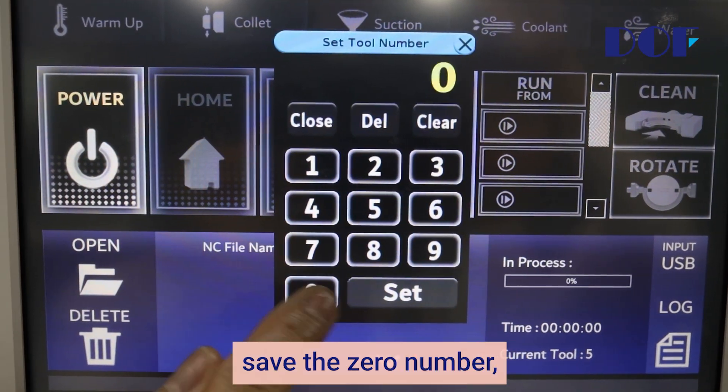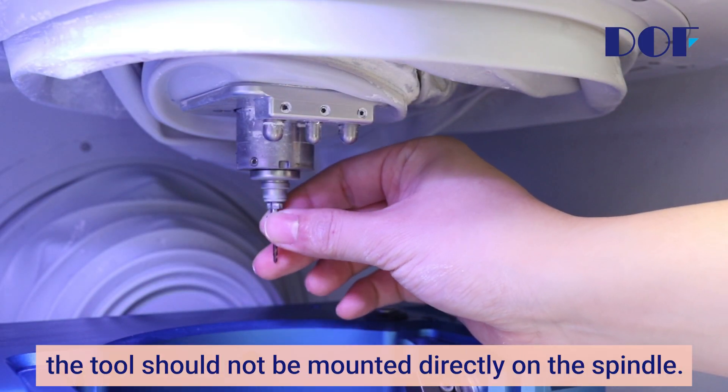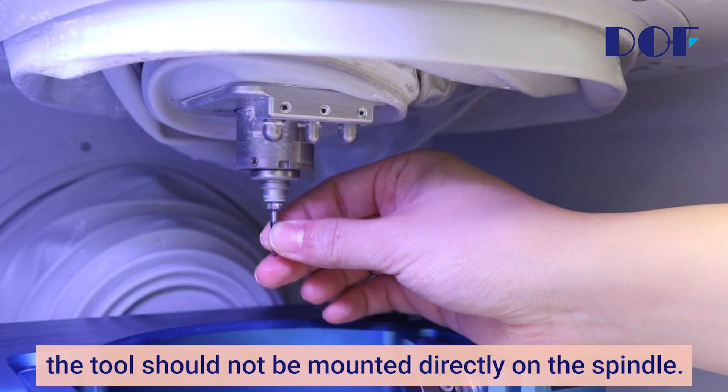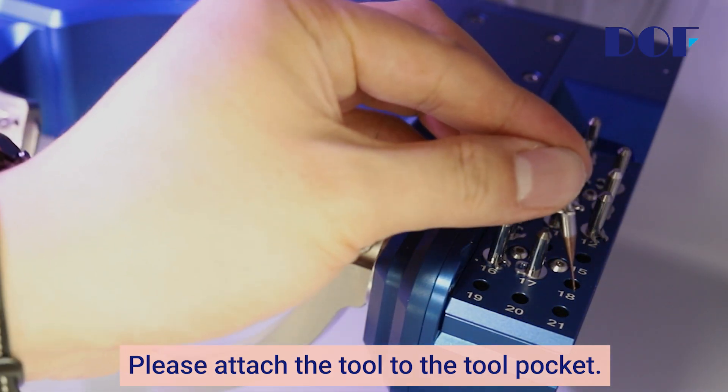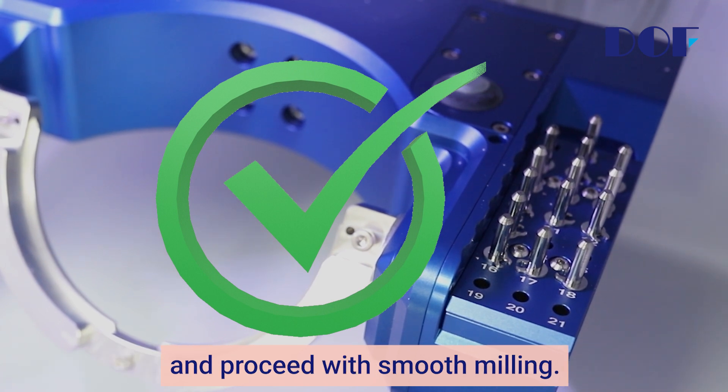save the zero number, which means there is no tool, with the set button. One thing to note here is that the tool should not be mounted directly in the spindle. Please attach the tool to the tool pocket. Only then can the Craft 5X measure the length of the tool and proceed with smooth milling.